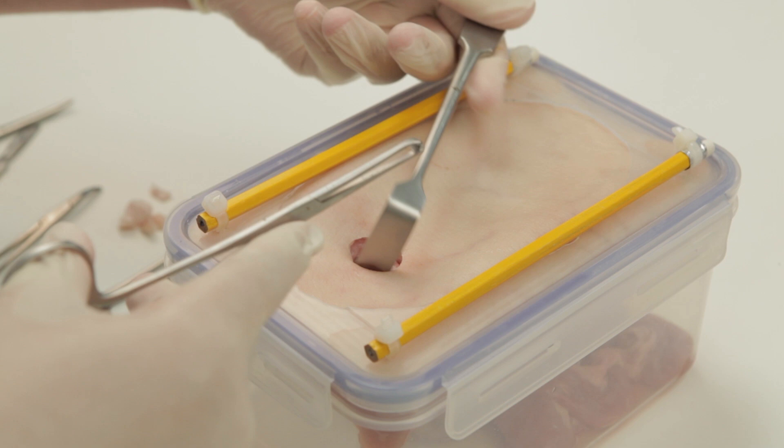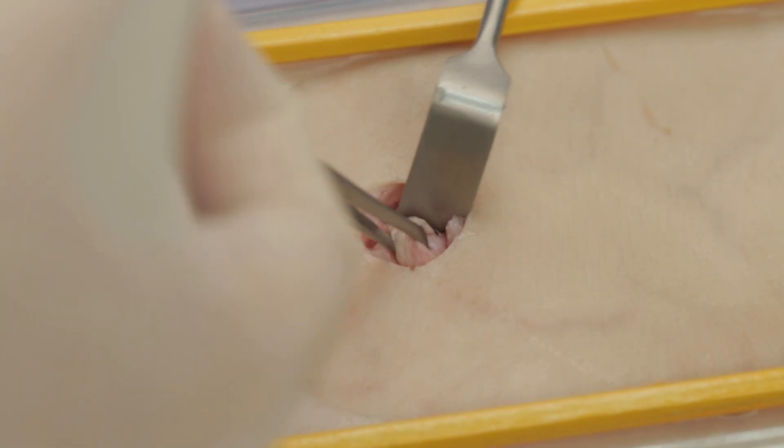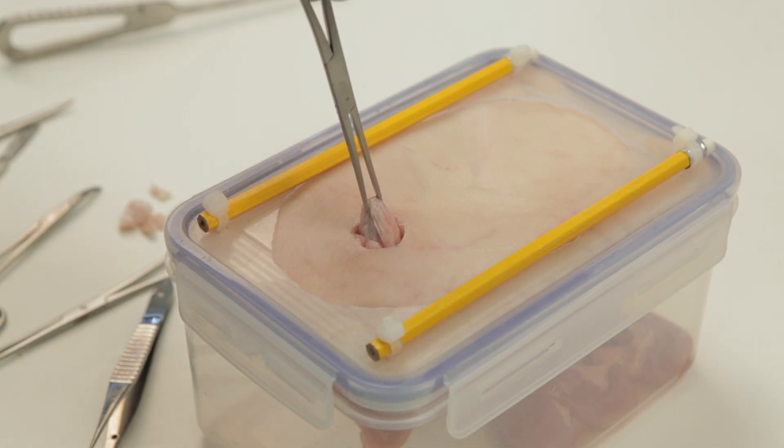Next, take a non-crushing bowel clamp to find and pull through the bowel being used for the ileostomy. Here, an Alice forceps is used for the sake of simulation; however, this should never be used in a real-world situation.